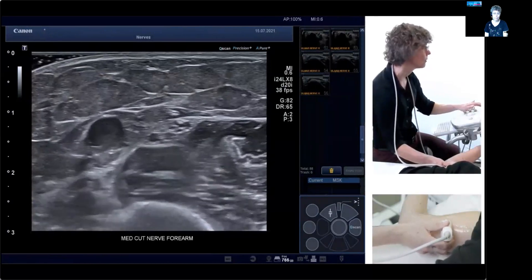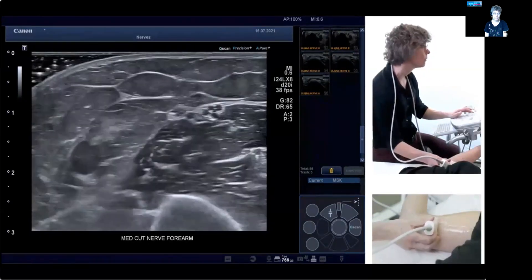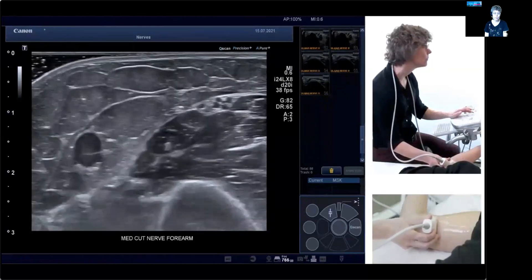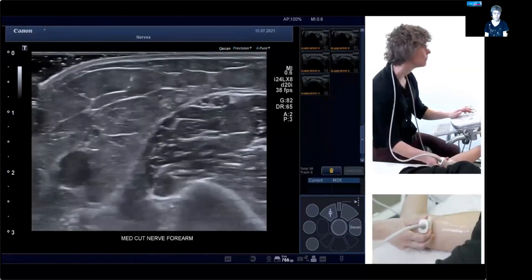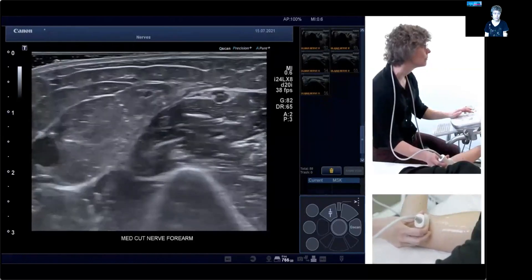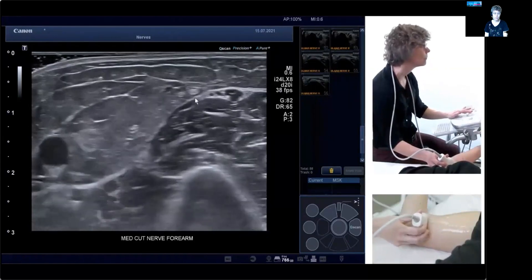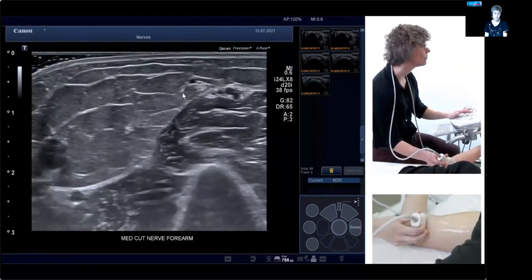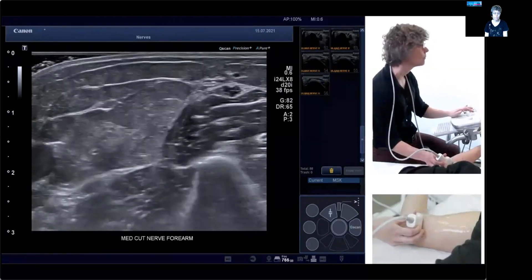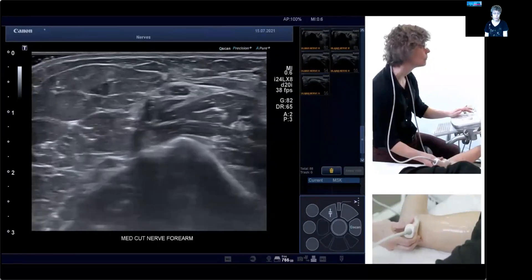Highlight it here. When we go distal, you can see that the medial antebrachial cutaneous nerve actually goes a little more posterior, but it will branch any second now — and there we are. You can see the nerve split into two branches highlighted here. If we go distal, there are the two branches of the nerve, always just above the fascia. From this point on, you would have to choose whichever branch you would like to follow.